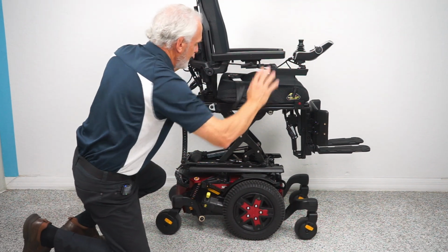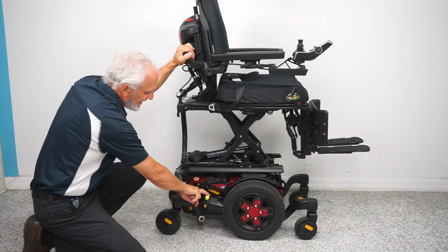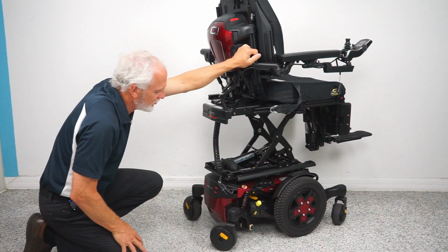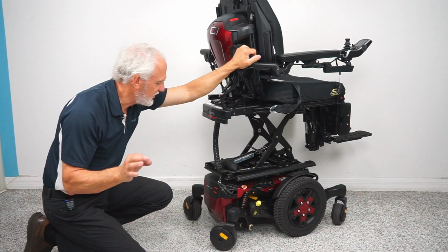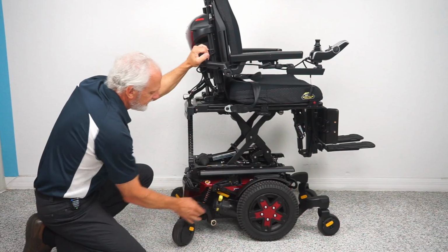Turn the power off because these are electric motors. Power is off. Go to your neutral lever, push it down, and now you're in neutral. You see how well built these chairs are? I can do it with one finger, okay? Put it back up, and that's it.